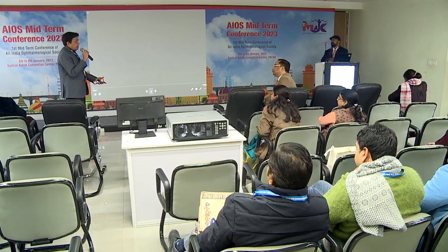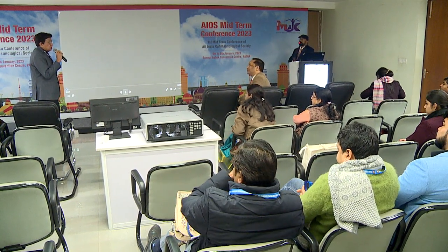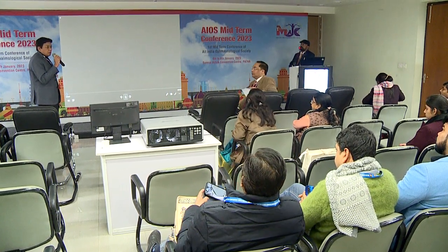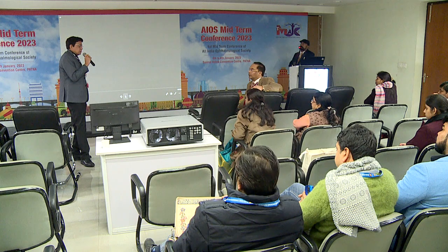Not needing reading glasses definitely helps. I do agree, not all pediatric ophthalmologists agree with this concept, but in our hands it has worked. Less than 6 years we don't use it, but beyond 6 years we don't mind using these, especially the current crop of good trifocal lenses as well as EDOF lenses.